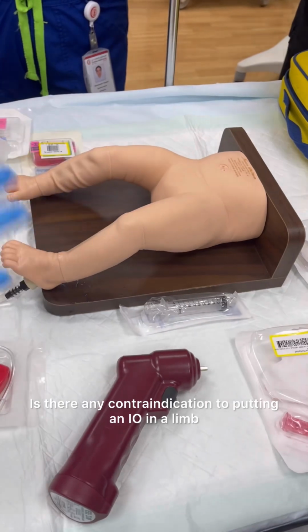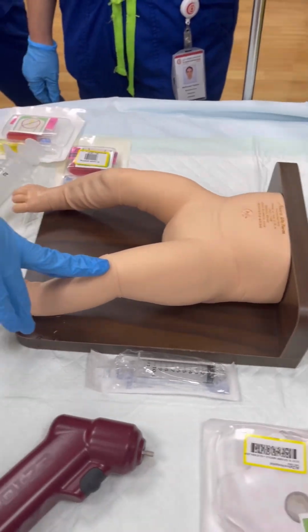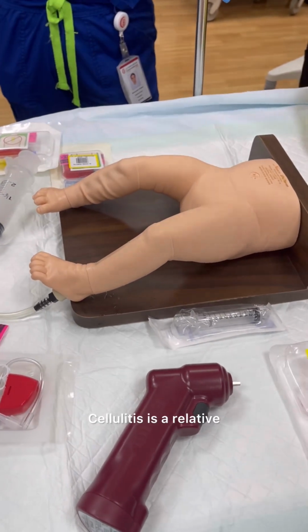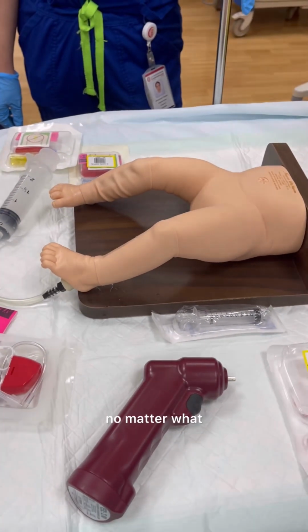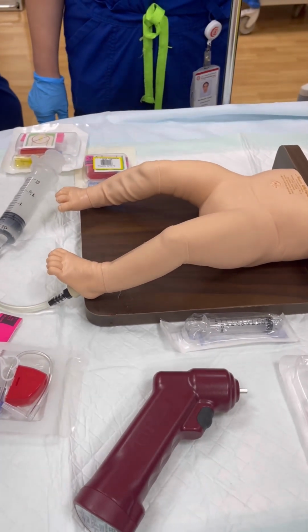Is there any contraindication to putting an IO in a limb? I just said amputated, of course you cannot find a site. Any other contraindication? Cellulitis, maybe? That's relative. I'm saying no matter what, you cannot put it. It's absolute. Cellulitis is relative. It's like giving thrombolytics to somebody who's got a bleed. This is absolute. No matter what, you're not allowed. What is an absolute contraindication to putting an IO? Everything else you can negotiate.